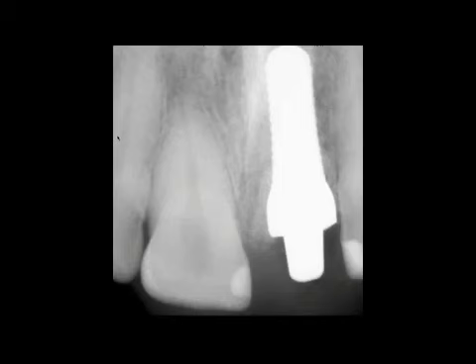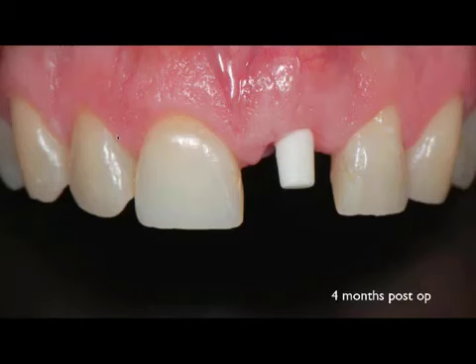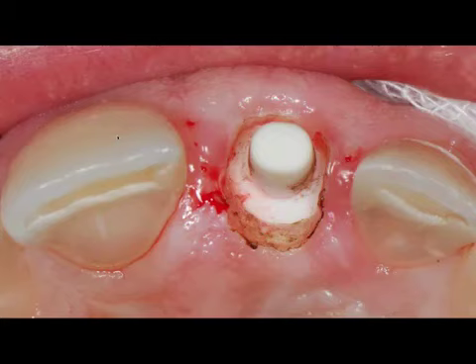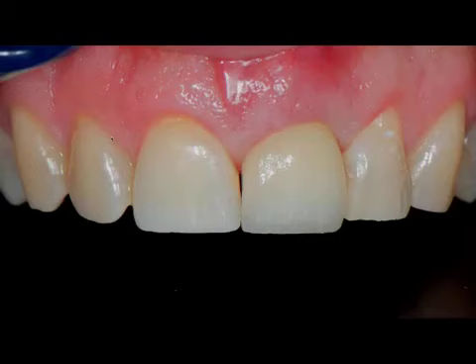Once everything has healed, again, the healed radiograph, we're ready to restore. We use either a laser or an electric knife to trough around a little bit of the tissue. We're ready for a pickup impression, and we fabricate the crown.